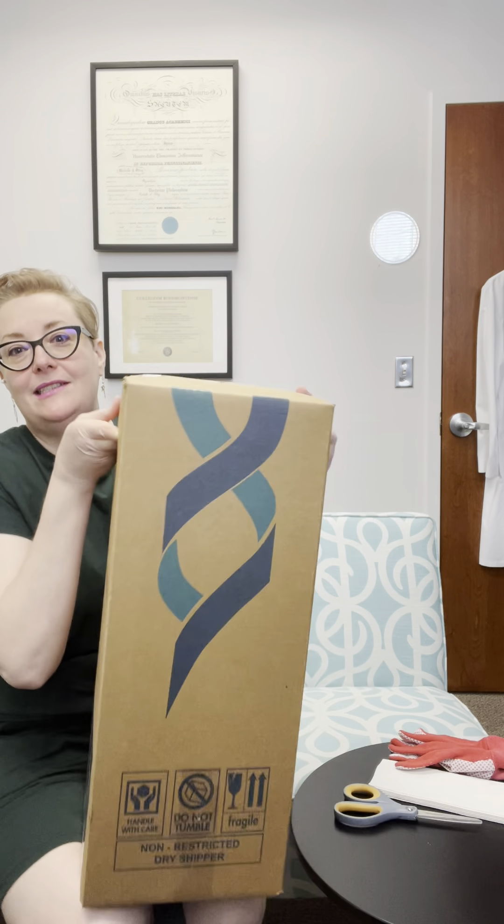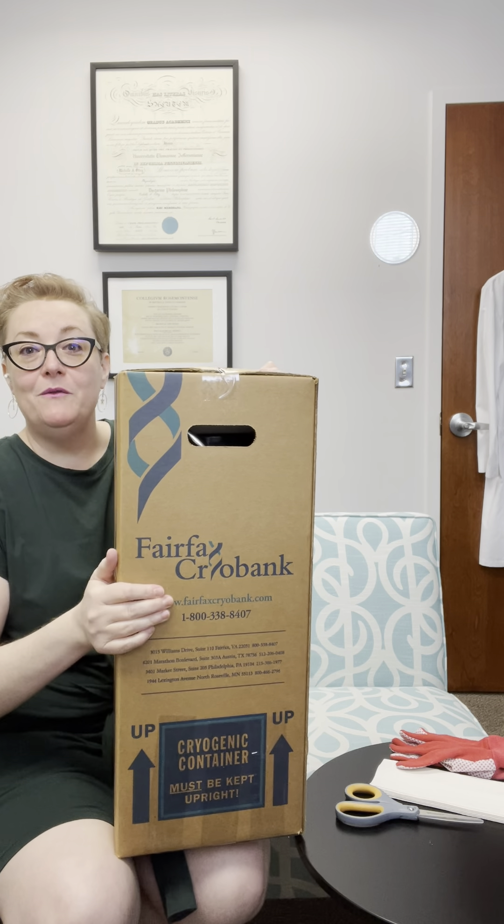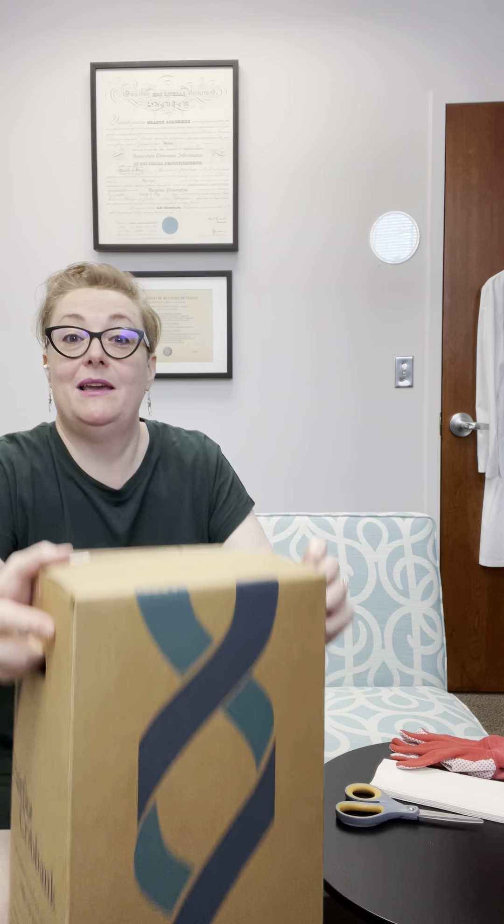First thing I recommend is have everything ready. You'll need scissors or a box cutter to open the box. When you receive your box — a lovely labeled box from Fairfax Cryobank with your shipping tank — check it first. Check all of your paperwork. Open it up, go through the paperwork, make sure everything's good, and then leave it until you're ready to do your insemination.